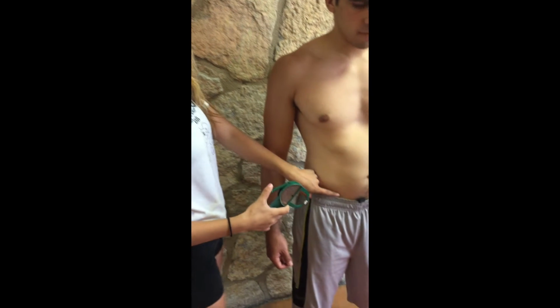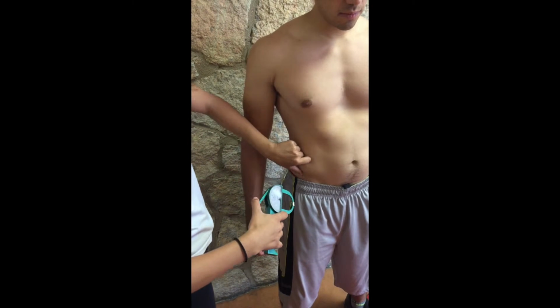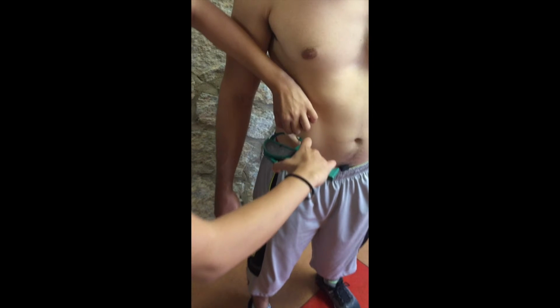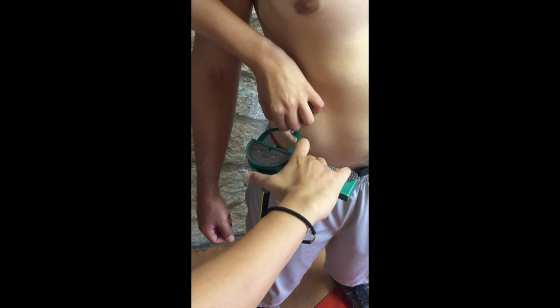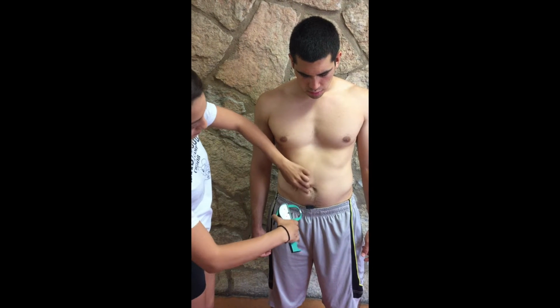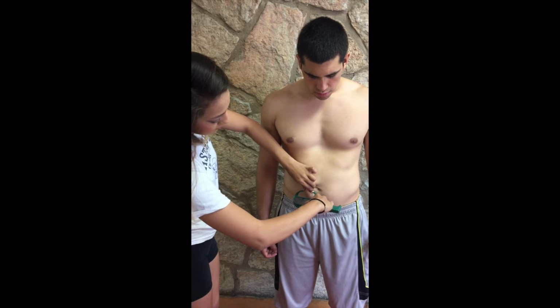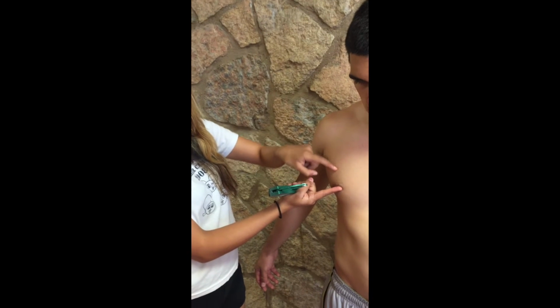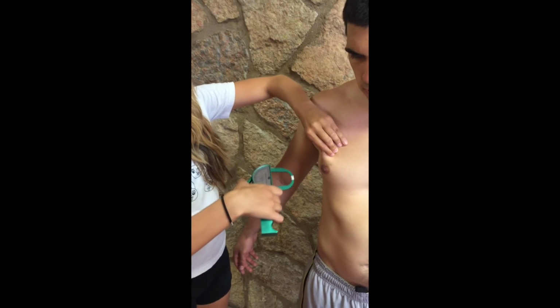The suprailiac is measured using a diagonal fold in line with the natural angle of the iliac crest. The abdominal fold is taken about 2 centimeters to the right of the umbilicus in a vertical fold. The chest is measured using a diagonal fold.